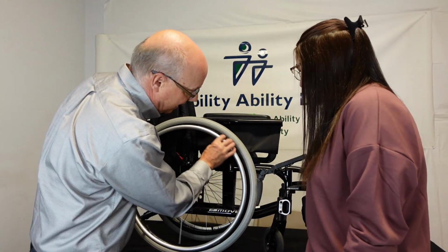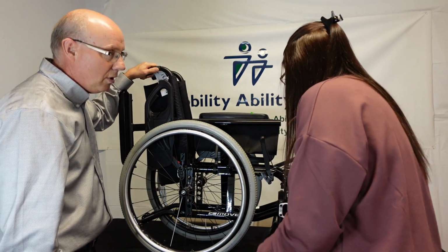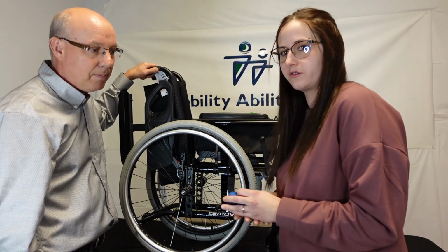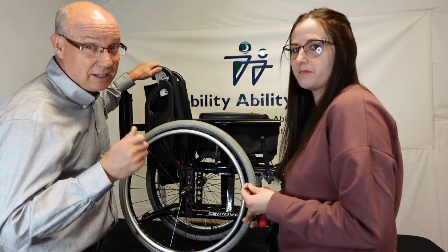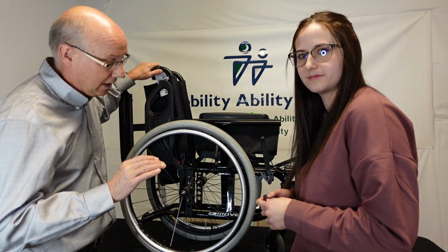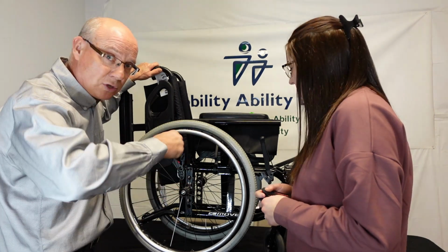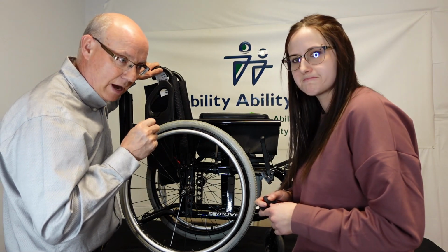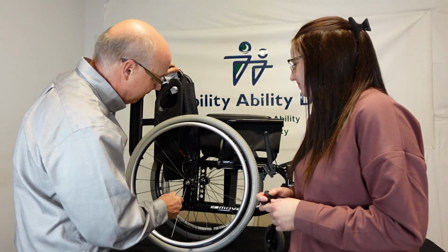So we see that it's not locking. What are you going to do? We're going to adjust the brakes. We have two sets of Allen keys, one metric, one standard, and one is going to fit perfectly, and one's going to be a little bit loose. So we're going to give both a try. The Allen keys are so important. You've got to have metric and standard Allen keys, and then try them so that there's no slop in it, because we run into so many problems where the bolts that adjust the brakes are stripped. When they're stripped, it's a concern.